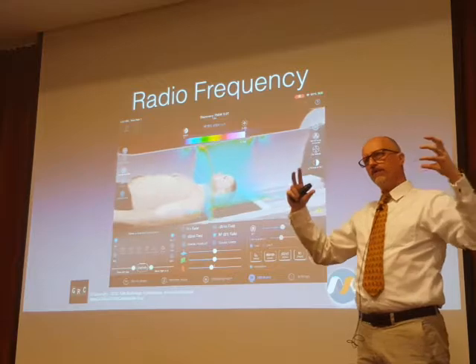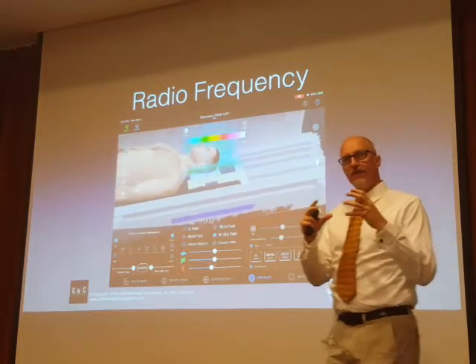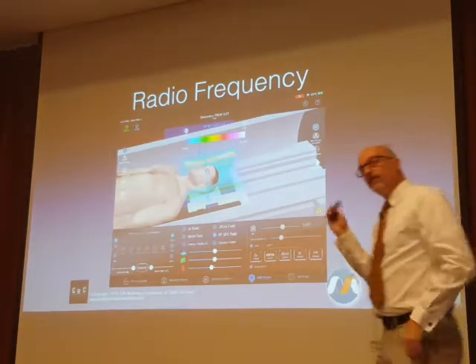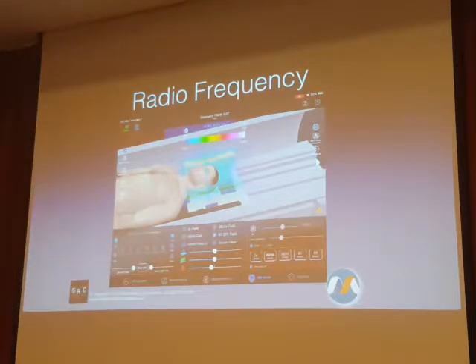It's at the ends of the birdcage quadrature RF transmit coil. It is not maximum at the center. What this means is, if you're doing a head study and you're using the body coil for transmit, the most likely place that you're going to produce a burn in that patient is in their upper arm or their shoulder.